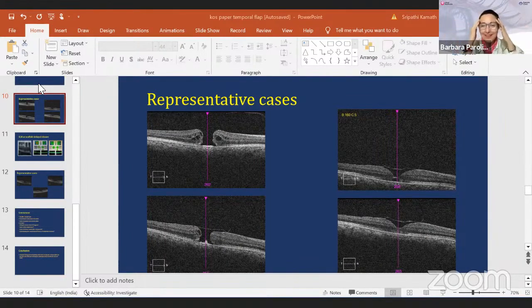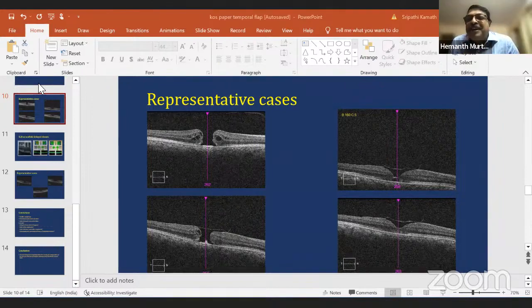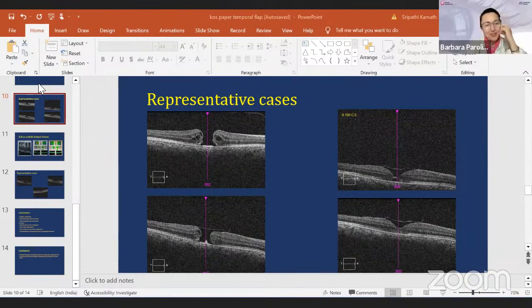It made me think a lot that in the first maneuver I made the hole smaller, and then by removing the cap of ILM, I made the hole like it had never been there. That is one reason why in small holes I think it's better to remove the ILM rather than having an inverted flap, because then you have no possibility of it going down inside. It's true.